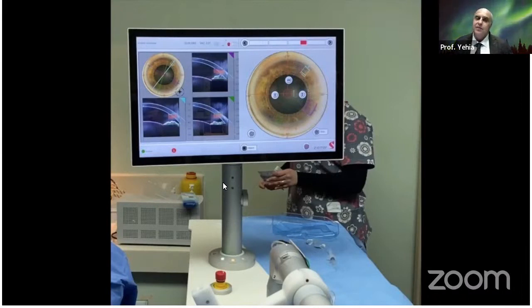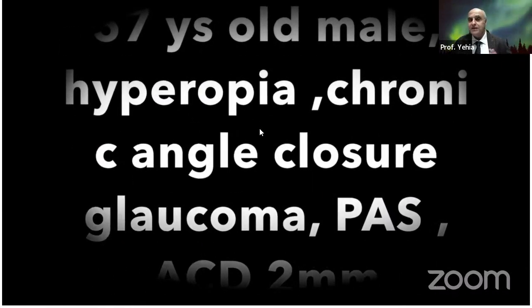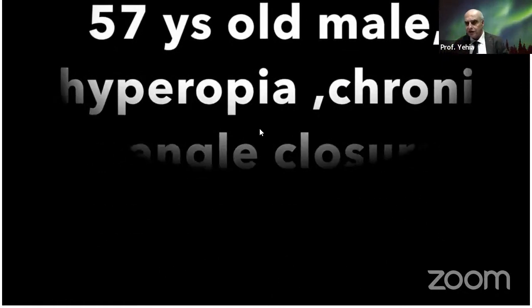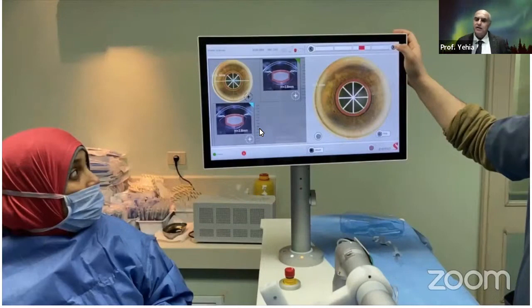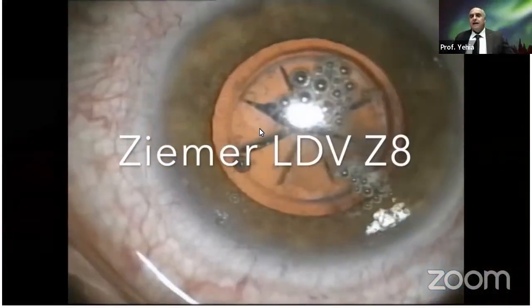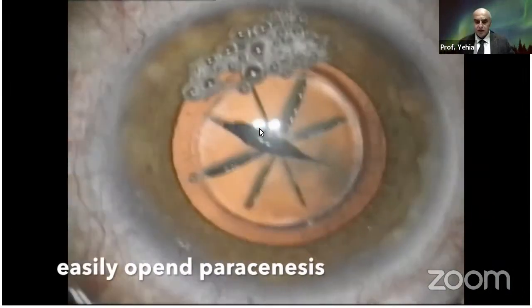In this case, I will do my rexis, which is one of the difficult things in a very shallow anterior chamber. And I'll do my incisions, constructed where I want. I thought this might be useful. It's a patient who had peripheral iridotomies. He has chronic angle closure glaucoma. Pressure was controlled by 2-3 drugs. And I decided to do phacoemulsification and goniosynechialysis.